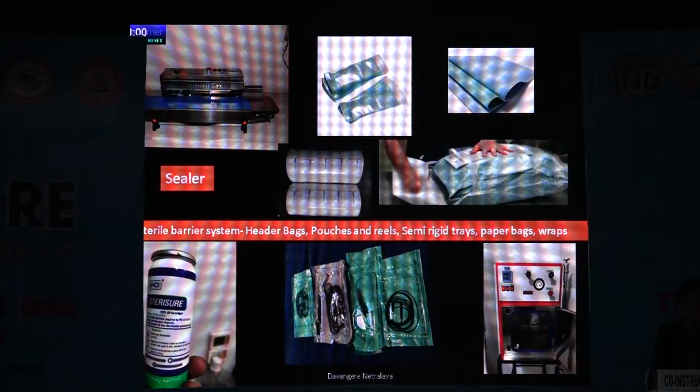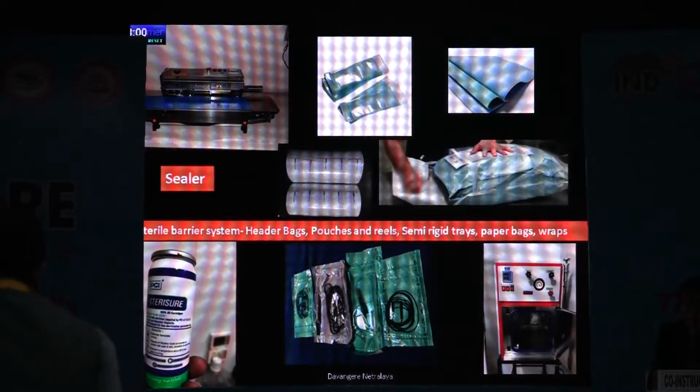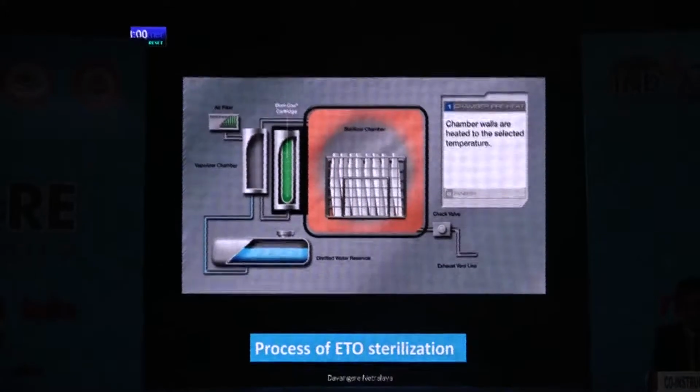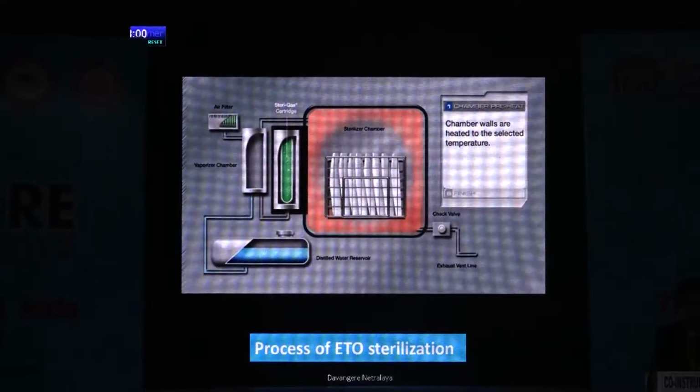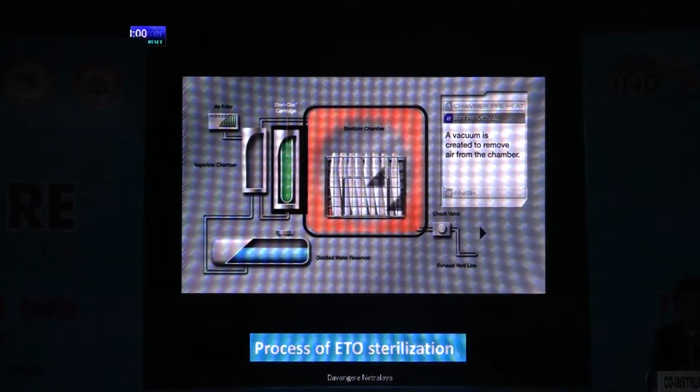Wrapping and other things are the same as for any class B autoclave you use. One side is semi-transparent, where you can use the indicator, and the other is opaque paper material. So looking at the process of ETO sterilization, the first step is preheating. During the preconditioning phase, you start to heat the chamber to a particular temperature. Then you take out all the air present in the chamber. A vacuum is created by removing the air as much as possible.